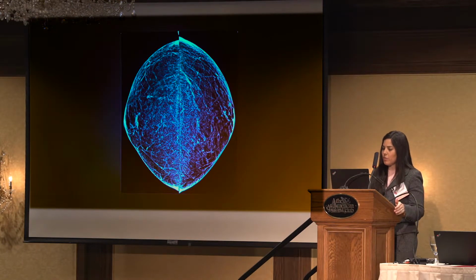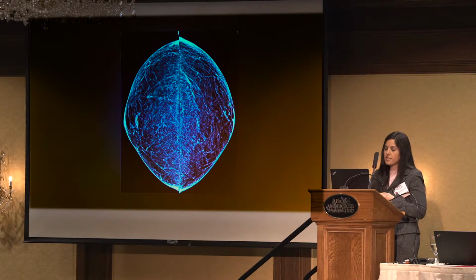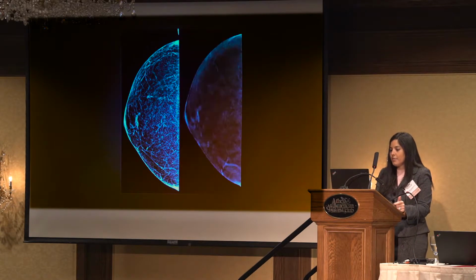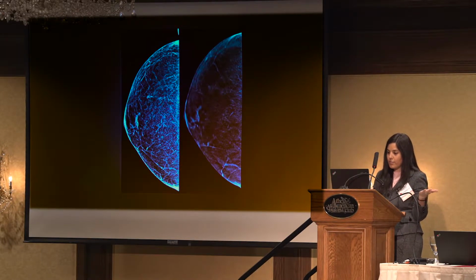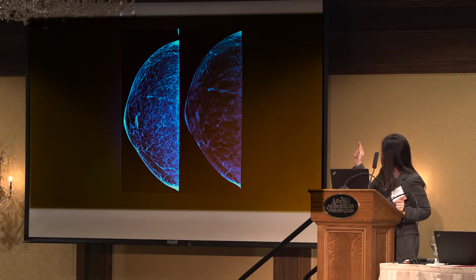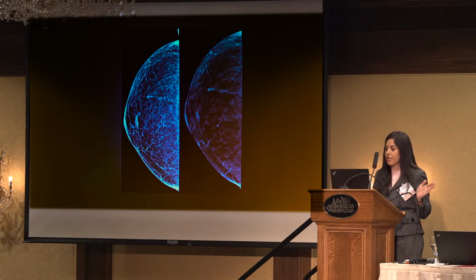This is a case of a woman who came in, I think it was for breast pain. She had priors, we just didn't have them when she showed up. She'd had a prior breast reduction, which is why her breasts look funny. So you see this asymmetry in the lateral right breast at middle depth, and you're like, what is that? I wish I had comparisons, but her comparisons aren't there, but she thankfully had a tomo exam. So as you scroll through the tomo, you see that it's just a little vessel curlicuing on itself. BI-RADS 2, maybe BI-RADS 1 if you choose to just ignore it. Don't need to spot it, don't need to ultrasound it, don't need to do anything.